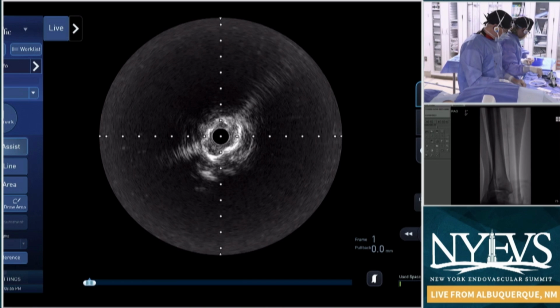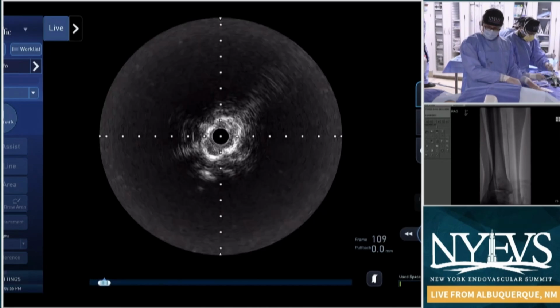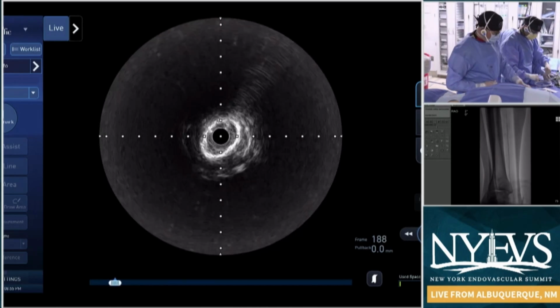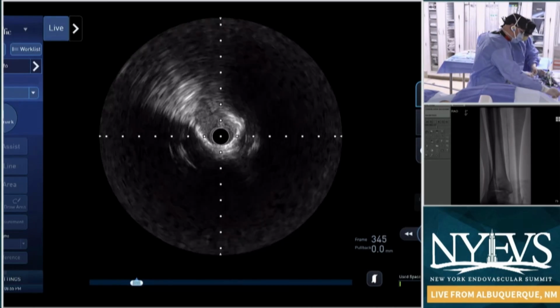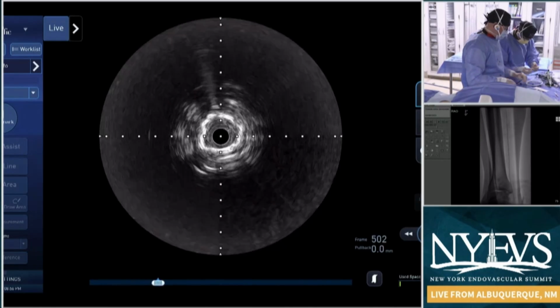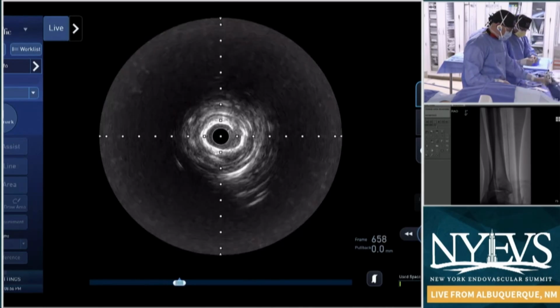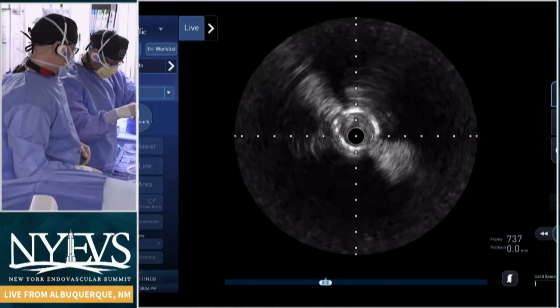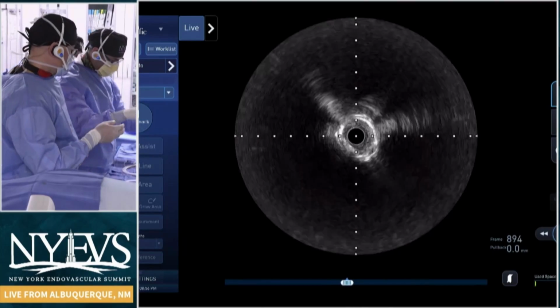How does the panel feel about this? Oftentimes we think we're completely intraluminal, and there may be small, short segments of subintimal crossing. Does that change your choice of vessel prep or atherectomy? Peter? So, from my perspective, especially looking at this, I don't know how you wouldn't put in a Diamondback. For a short segment subintimal location, it doesn't change anything for me. But if it's a long subintimal crossing, then I think it changes which device. If we're going to use atherectomy, I think you almost have to go laser at that point. Does everybody pretty much agree?